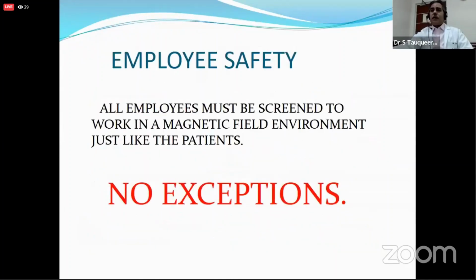For employee safety, the safety measures should be applied to everybody, whether it's MR personnel or radiology personnel or hospital workers or anybody. Employee safety is for everybody and everybody should be aware of this MR safety. There should be no exceptions.